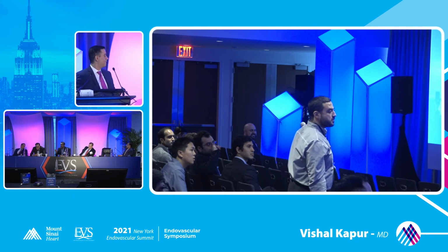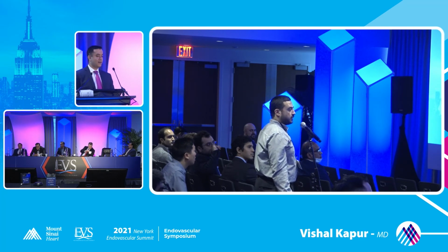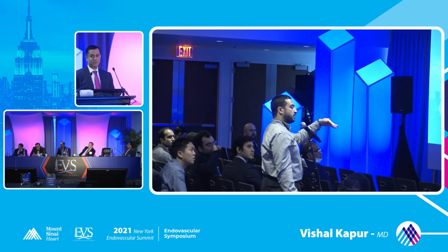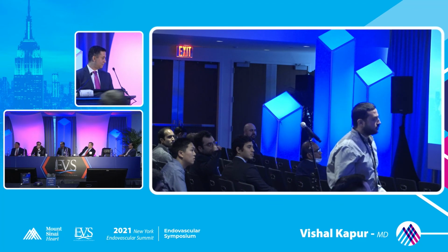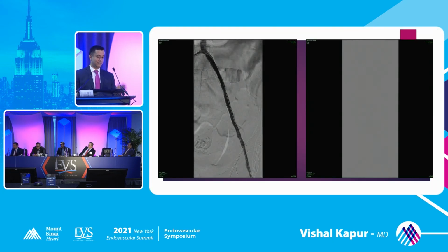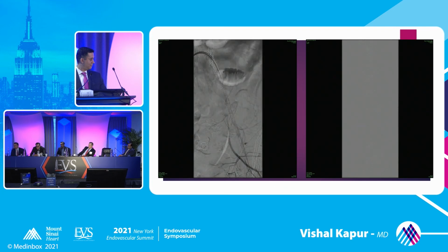You've got chronic thrombus in there with plaque. It's okay in coronaries in an acute situation. It wouldn't work up here. It may be acute. Sometimes a small dissection may trigger this thrombus. Not with an ACT of 280. No, I don't think so. But you should be careful giving a potent anticoagulant, a platelet inhibitor, in a patient with a perforation, even if you have a covered stent, and you have 2 accesses, potentially 3 accesses. So you should be really careful. And like Dr. Sachar said, it likely is not acute; it's probably chronic. Okay. All right.